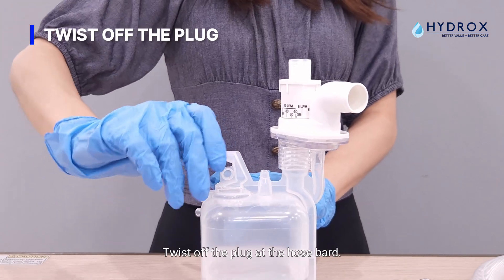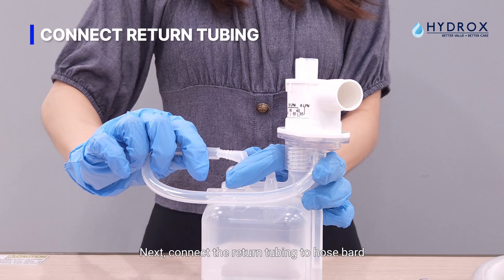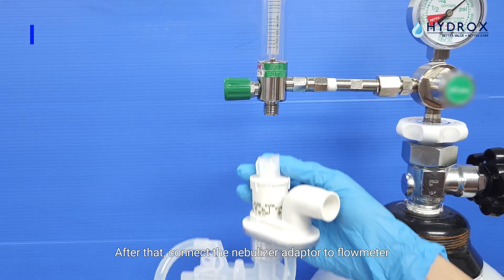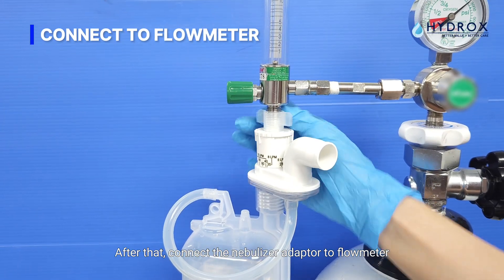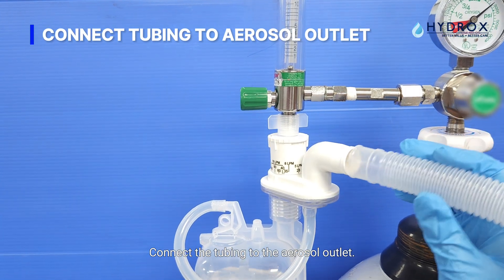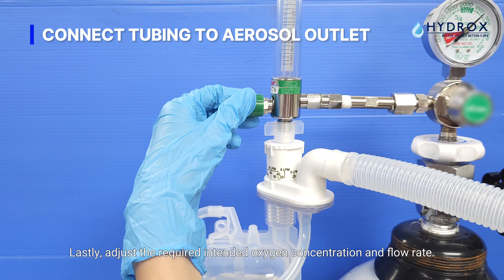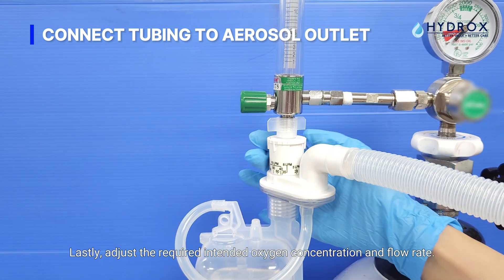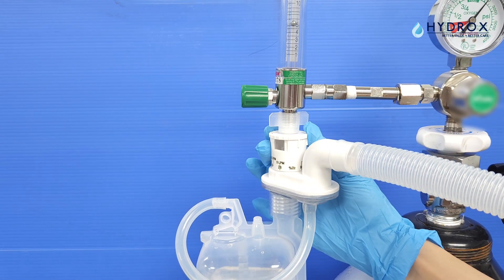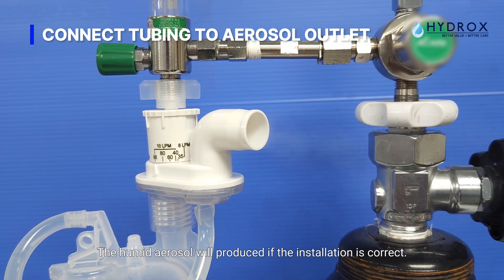Twist off the plug at the hose bar. Next, connect the return tubing to the hose bar. After that, connect the nebulizer adapter to the flowmeter. Connect the tubing to the aerosol outlet. Lastly, adjust the required intended oxygen concentration and flow rate. A humid aerosol will be produced if the installation is correct.